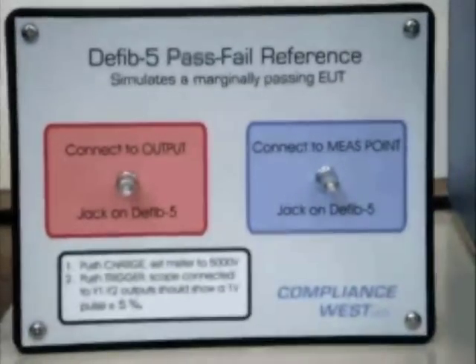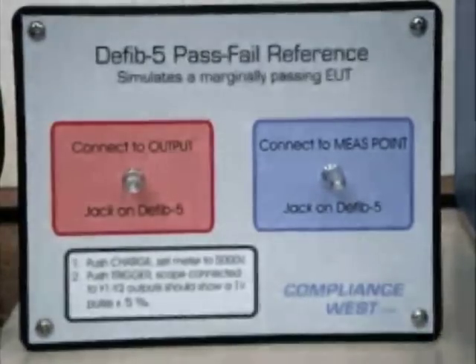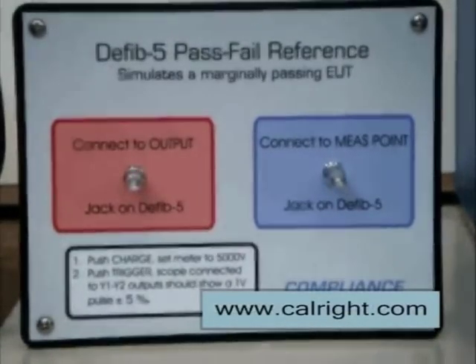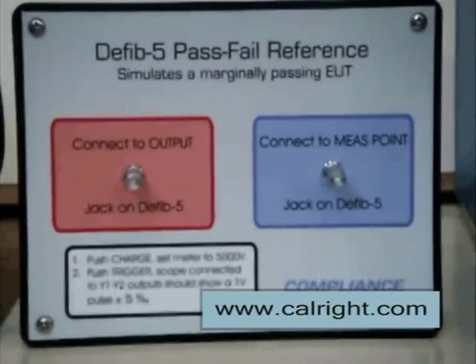We are going to demonstrate these connections, simulating the device under test with our pass-fail reference, which is designed to simulate a barely passing device under test. It will deliver one-volt peak to the oscilloscope. Per the standard, if the output to the oscilloscope is more than one volt, the result is a test failure.